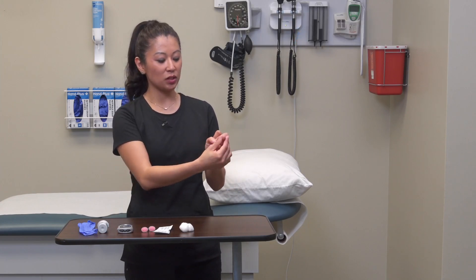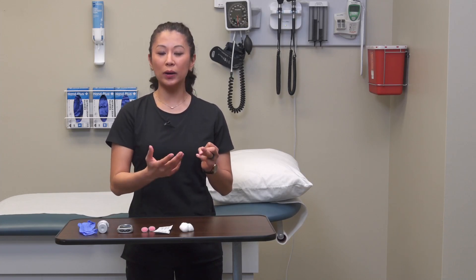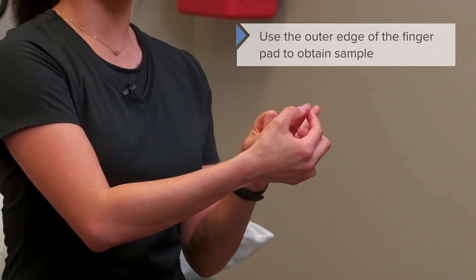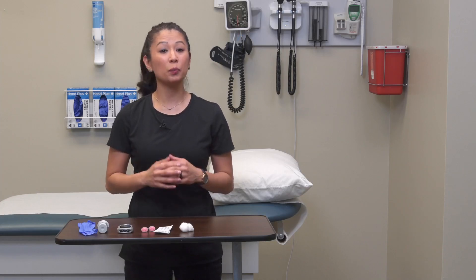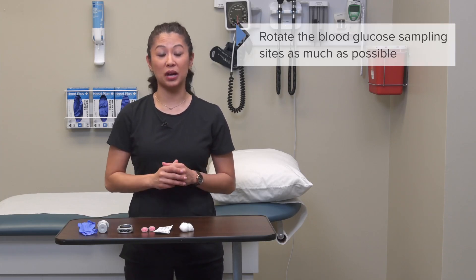Identify a puncture site — typically the patient's fingers. I'm going to use this finger here. We avoid the middle pad and go to the soft, cushy side portion of the finger. Also note: if your patient is diabetic and has been poked frequently, you can see those little pin pricks, so rotate sites as much as possible.